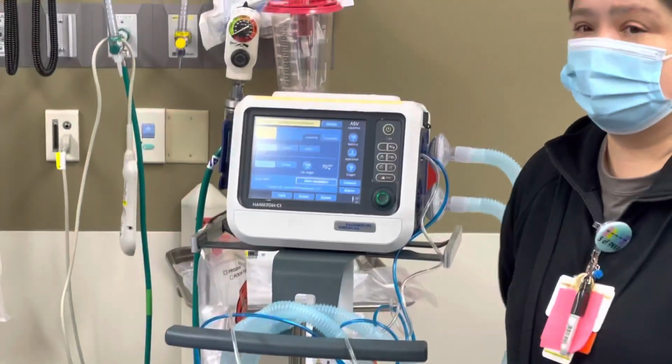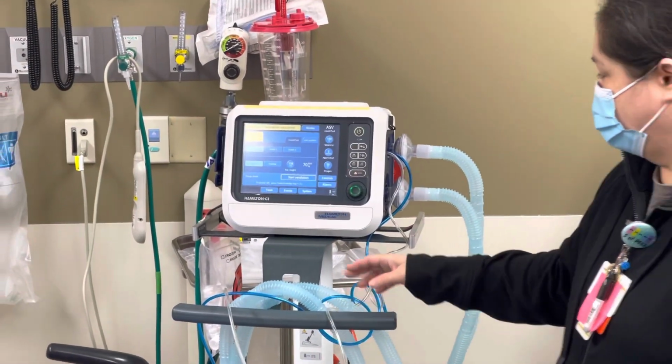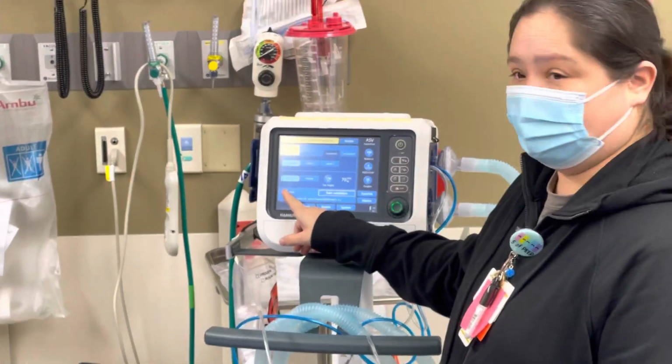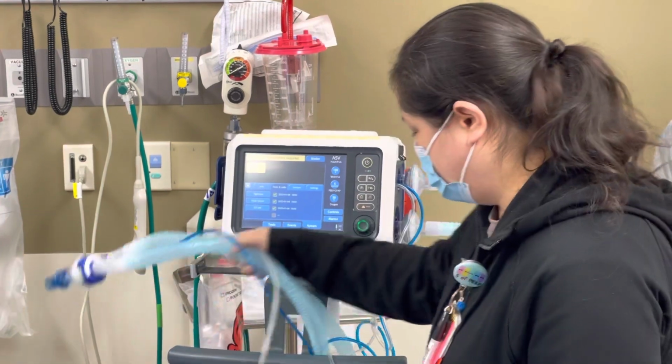Alright, so one of the first things that you'll want to do, of course, after you clean everything and you get a whole new, brand new circuit, is you want to do your pre-op check. So this button right over here will say pre-op check. Go ahead and hit that, and you're going to go through these 3 steps.